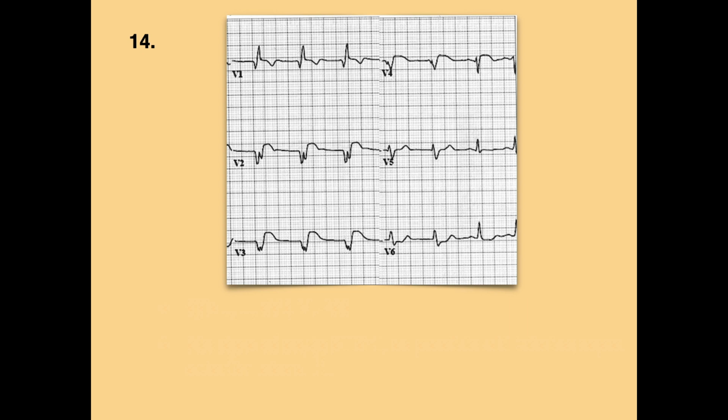Okay. So then 2 is elevated, 3 is elevated, 4 is elevated, 5 is not. 6 is not, yeah, maybe, hard to say because this looks so different from here. Okay, so do you have Q waves? There are Q waves. Where? Pathologic Qs, maybe. I don't think this counts as 25%, but it's hard to read these ones. But if you look at it, is there one small box between here and here? I think so. So then it would be pathologic.